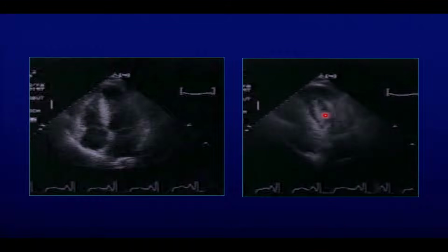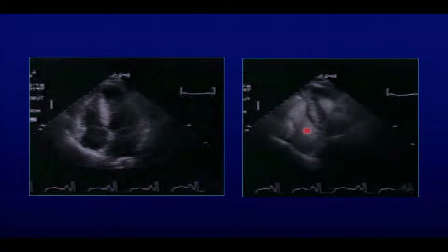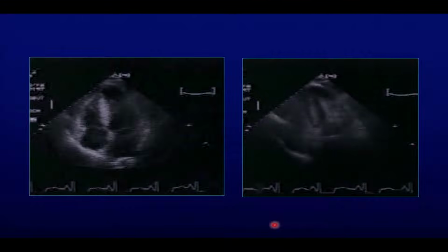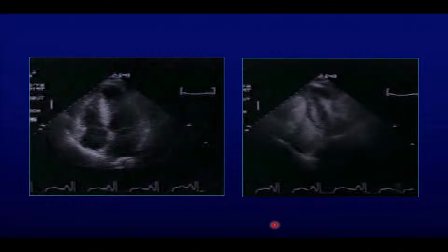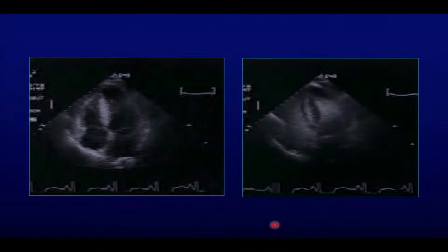It's a hypertrophic cardiomyopathy with the asymmetric type, and the diagnosis is very different. So the message is, if I don't see well, I need to see in the same setting. Don't do it after the patient is gone. You have to make sure that you take advantage of the situation, use it appropriately whenever you need it.